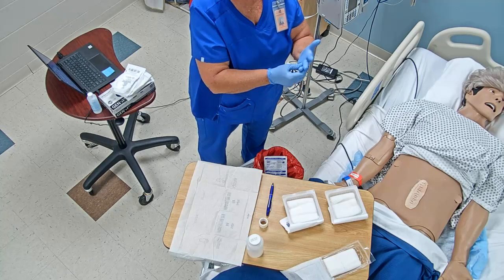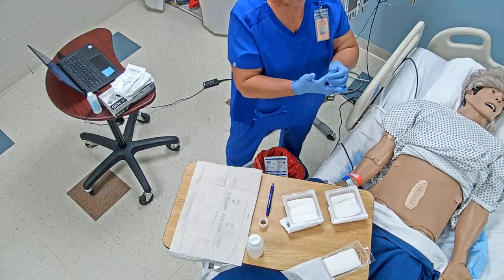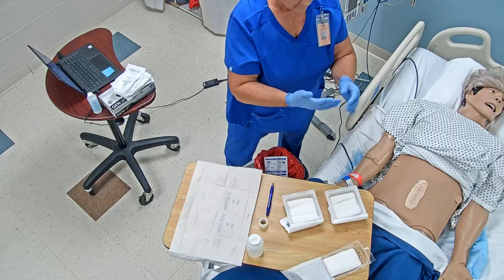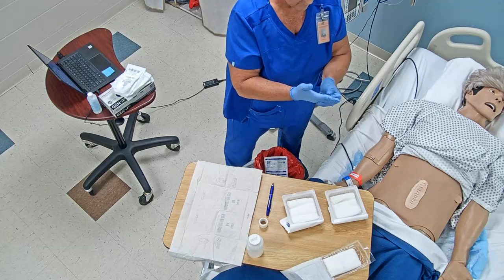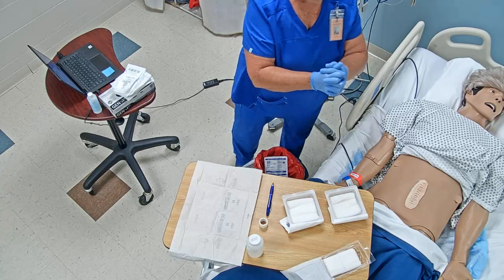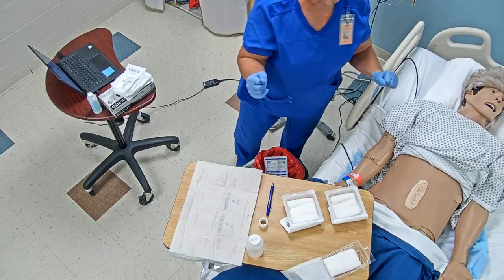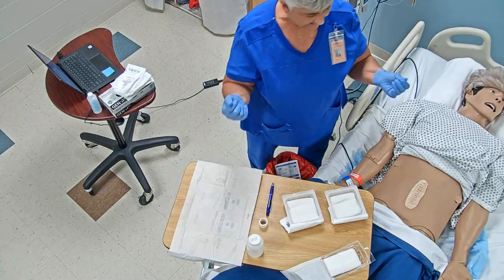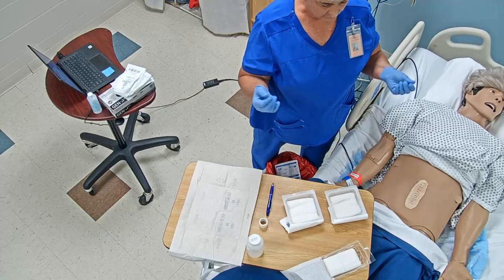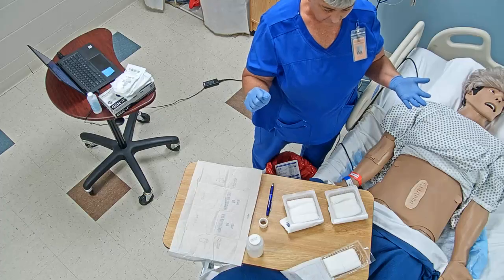You don't want the gloves way past your fingertips, because then that can cause you to contaminate your gloves or contaminate the wound. Okay, so I'm going to put my fingers together. I'm going to just check for integrity. I'm going to leave that package alone. Now, if I were going to do a culture, after I clean and dry, you do your culture, I could just lay it there on that till I get done.